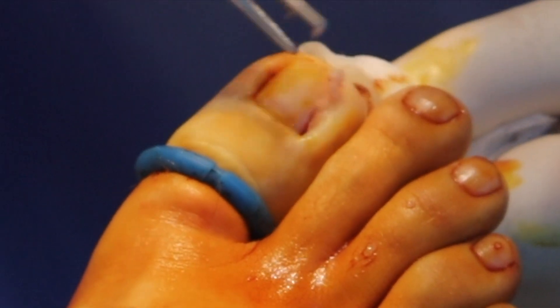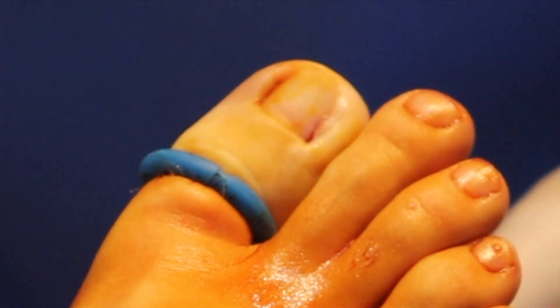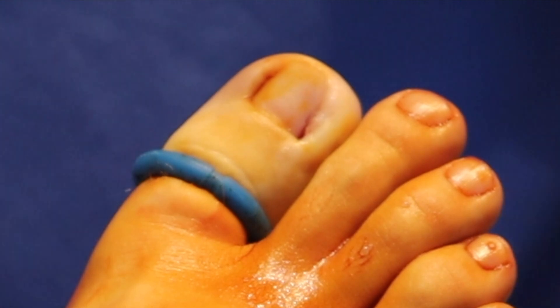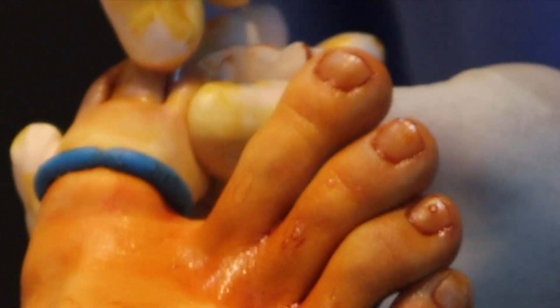We'll just remove a little bit of this excess, and we can see it already looks better and there's very little space there. What I like to do is just smooth away some of the root.